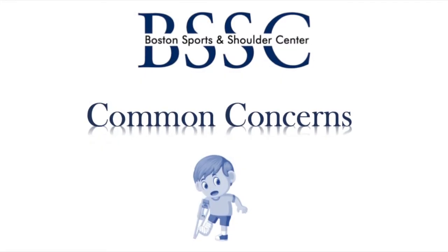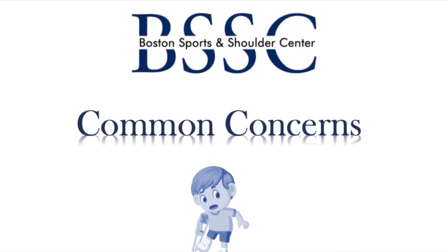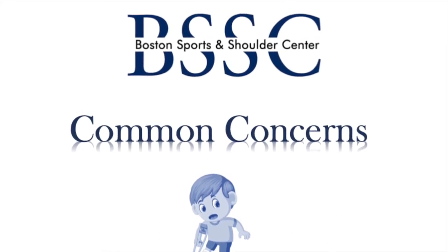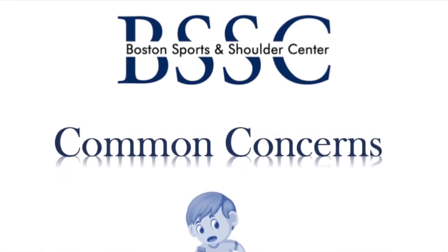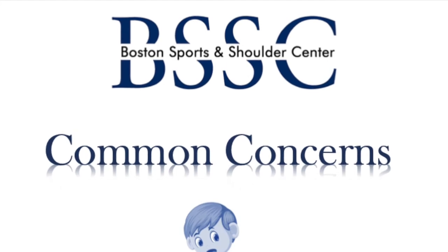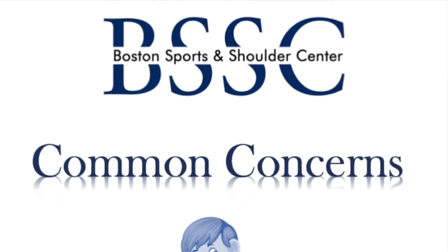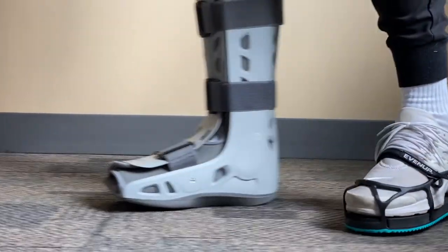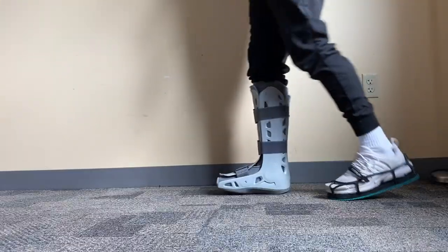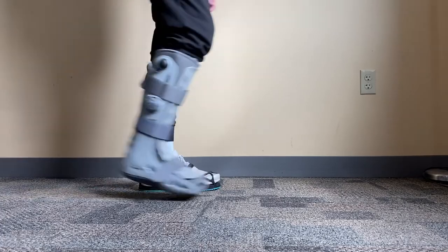It is best to wear a secure and supportive shoe on the opposite foot when ambulating with the boot. It is easy to slip with any other type of shoe. While slide-type sandals, flip flops, or slippers may be convenient, it is not recommended, nor are high heel shoes. Sneakers are a good option. While ambulating in the boot, some patients feel unstable or uneven, which may cause pain in other areas of the body, including the opposite knee, hip, and/or lower back. It is possible the shoe on the opposite foot is too flat. To correct this, choose a supportive shoe with a thicker sole or consider an even-up. Please proceed to the even-up video for more information.